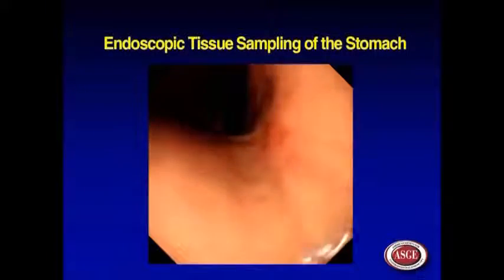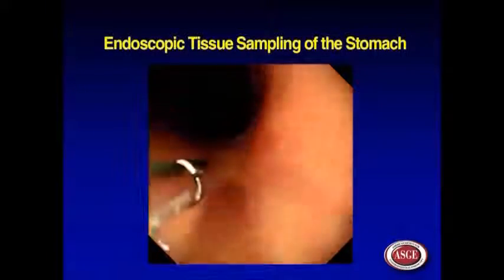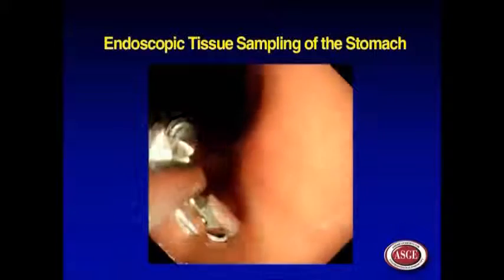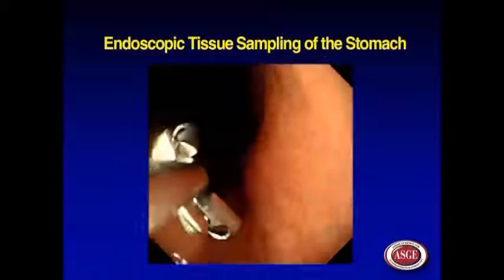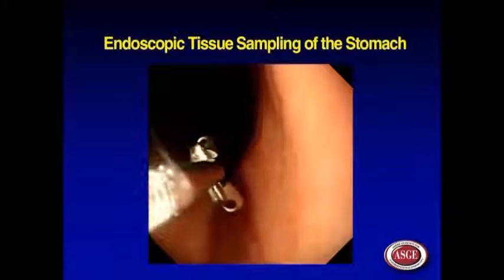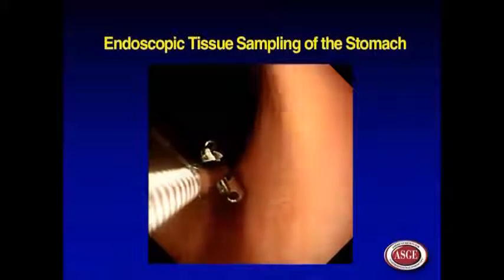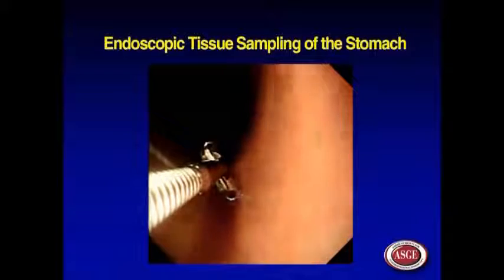For lesions near or on the cardia, the scope should be J-turned and withdrawn slowly to approach the target lesion.